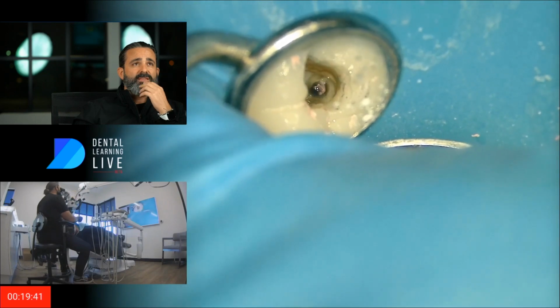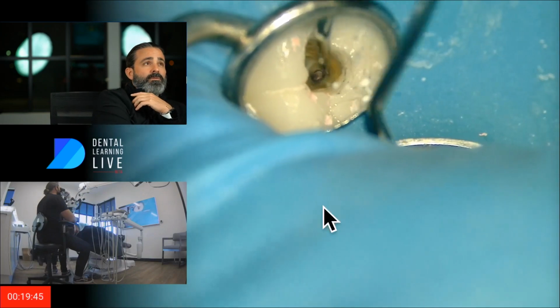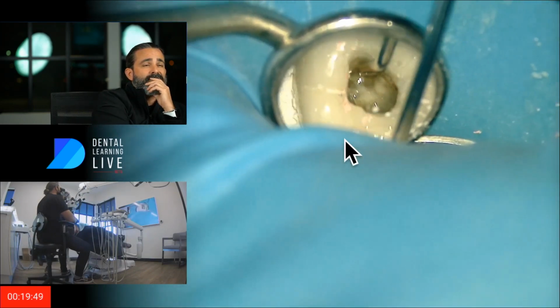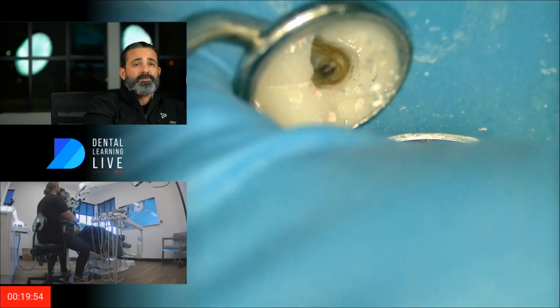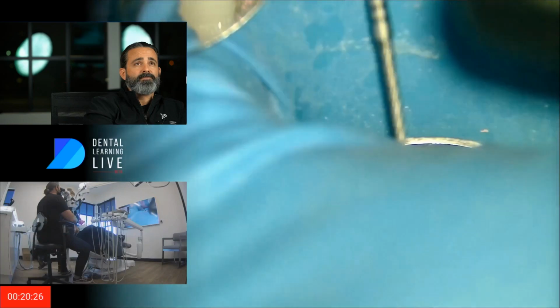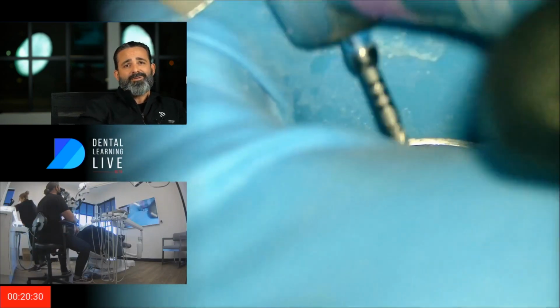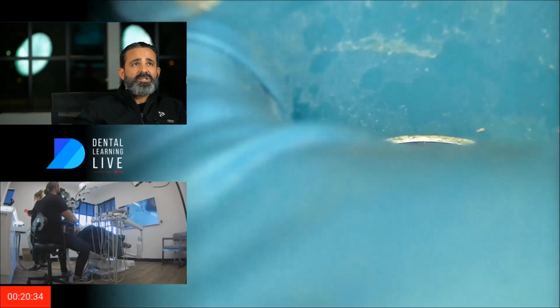And I can see certainly that in the palatal, the gutta percha right there. So I'm not quite done. We're going to keep playing here for a bit, pulling up pieces. And at this point, especially in that palatal, it got so frustrating and I just couldn't pick out those pieces and the 3D Shaper wasn't doing the job.